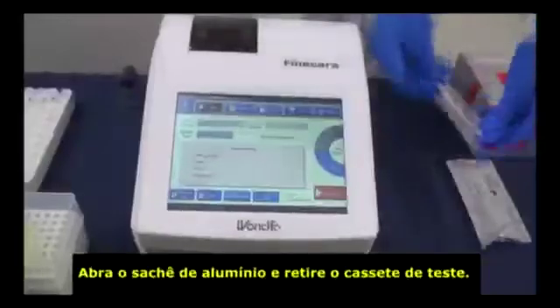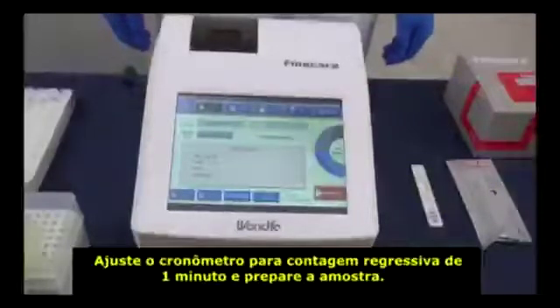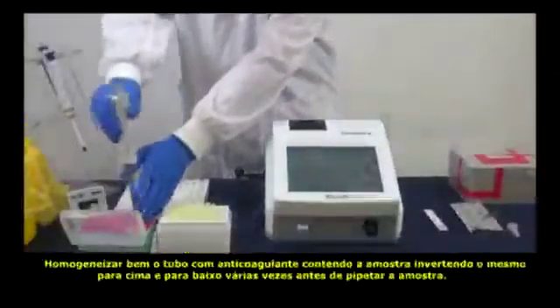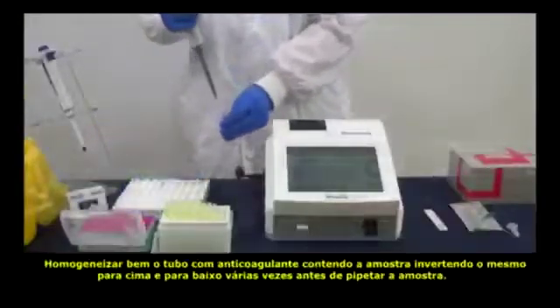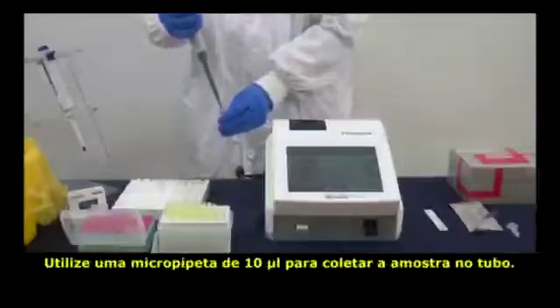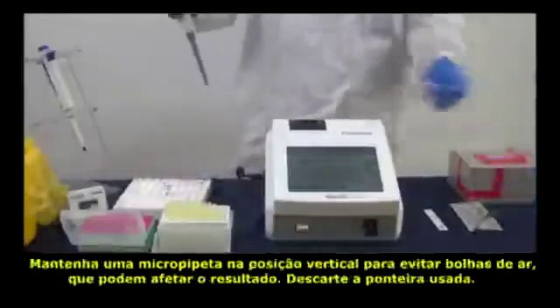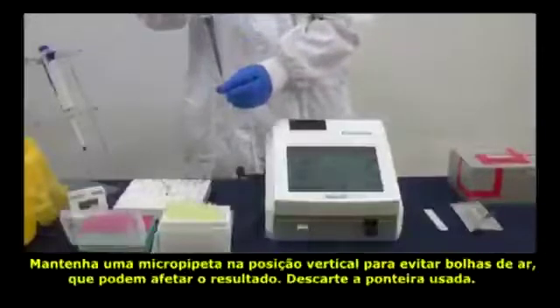Take out the cartridge from the aluminum foil bag. Set the countdown timer to 1 minute and start sampling. Note that the anticoagulation blood collection tube should be inverted a few times before sampling. Use the micropipette to take a 10 microliter blood sample, remembering to stay vertical to avoid bubbles which might affect the result.